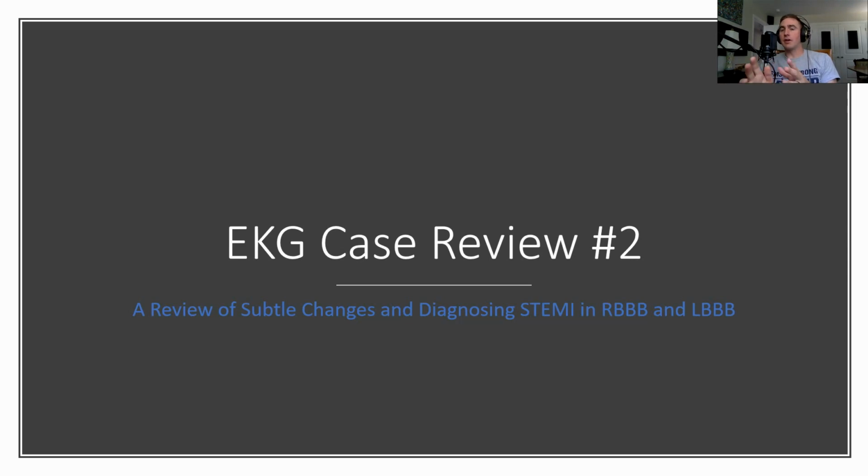And then we're going to talk about how you diagnose STEMI in a left or right bundle branch block, or can you even diagnose STEMI in a left or a right bundle branch block. And if you haven't learned any updates in the past few years, then I think you might be surprised by what we're going to talk about today.